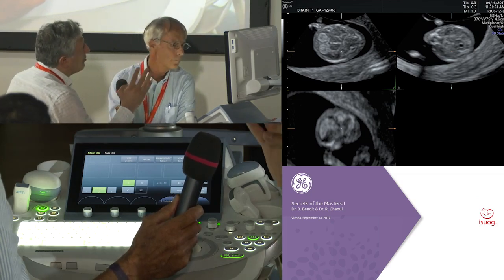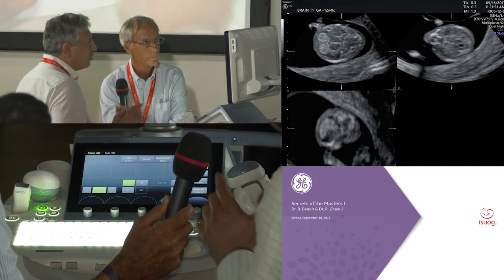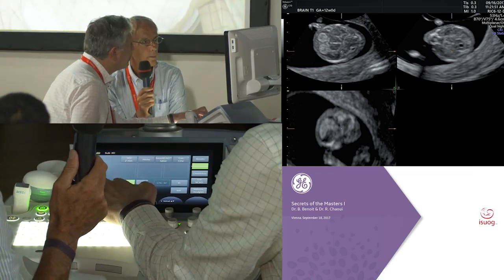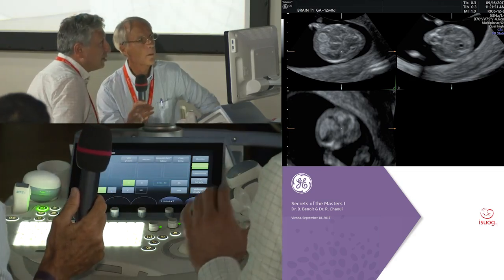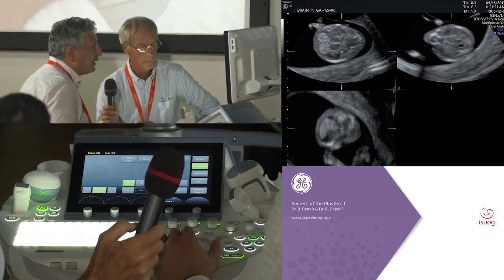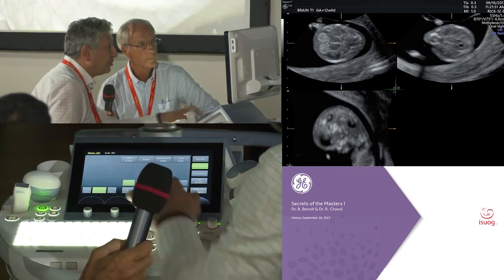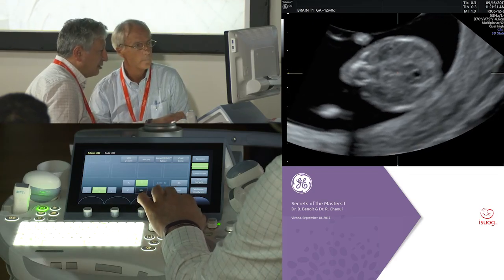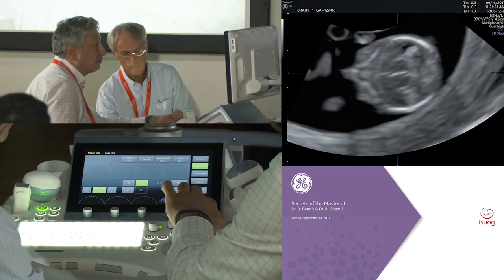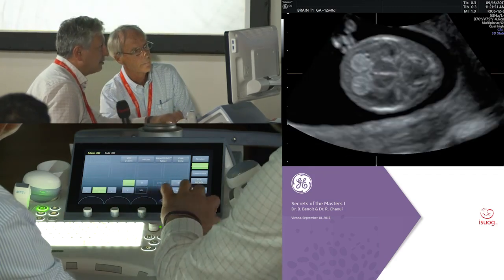So you magnify the image of the head, you acquire a volume as it is here, and then you told me number 4, we try number 4. Then you look at the ABC planes, and again I put the dot here. I go to the B plane, I adjust to have this view here and scroll. And look at the A plane, scrolling again.